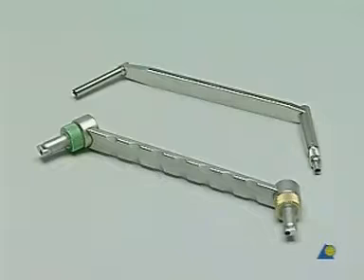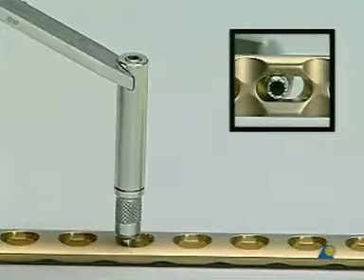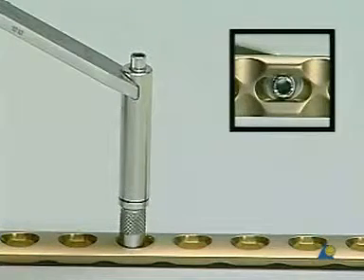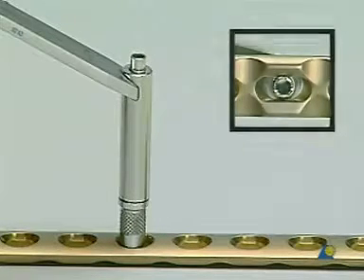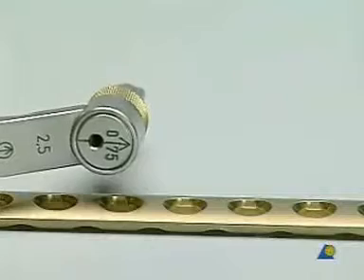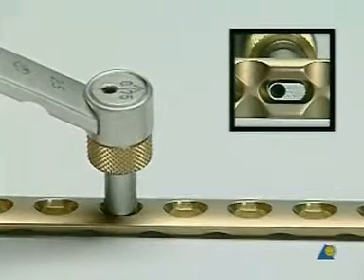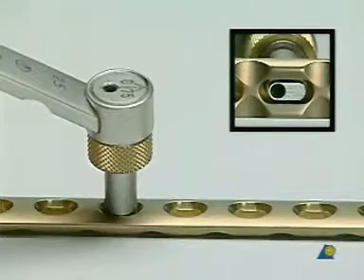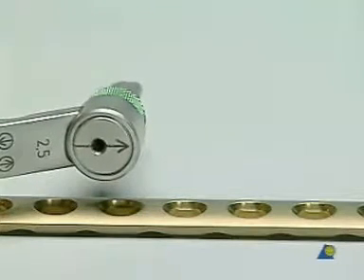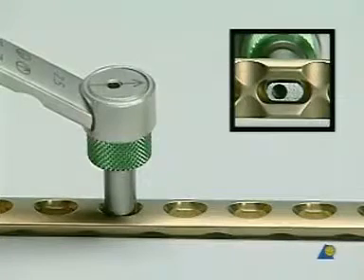We now show the two drill guides for the LC-DCP. The universal drill guide allows for eccentric placement of a screw when not depressed, and neutral placement of a screw when depressed. The yellow end of the LC-DCP drill guide with the arrow pointing towards the fracture will provide an eccentric screw hole. The green end of the LC-DCP drill guide, also with the arrow pointing towards the fracture, will provide a neutral screw hole. However, in our exercise the green neutral guide is not used.